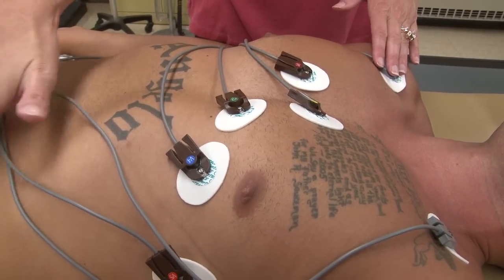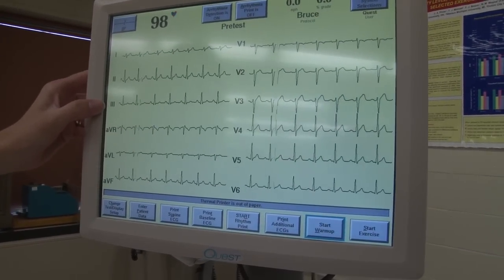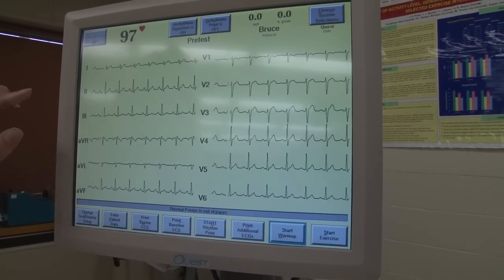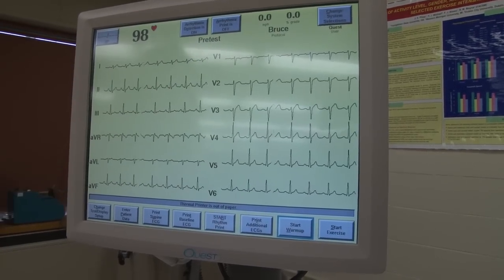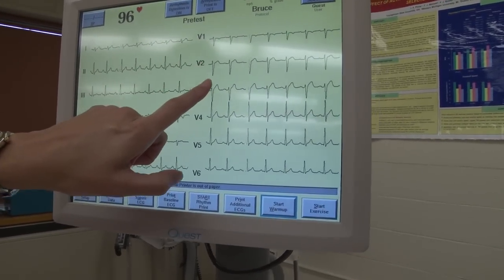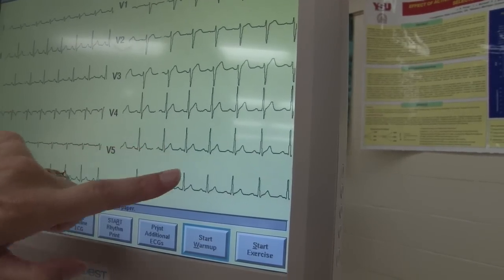Okay, so these 12 views allow us to see the 12 views that are presented here. If you look, here's lead 1, lead 2, lead 3, aVR, aVL, aVF, which is augmented voltage right, augmented voltage left, augmented voltage foot, and then V1, V2, V3, V4, V5, V6. Our precordial leads are here, and our limb leads are on this side. Now, also notice that, for example, in the precordial leads, V2 is mostly negative, whereas V4 is mostly positive. Positive meaning it's above the baseline. V5 is also mostly positive, above the baseline.